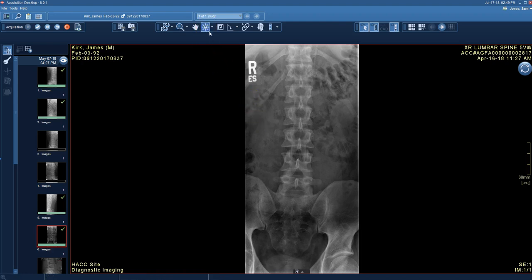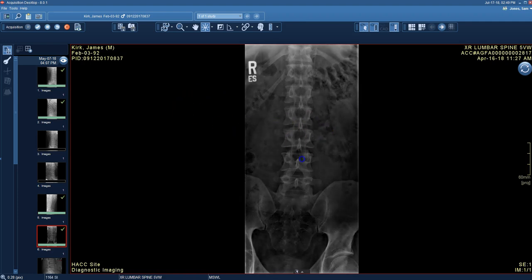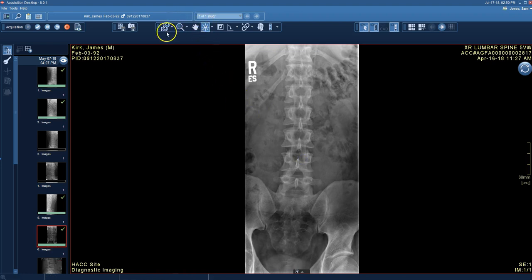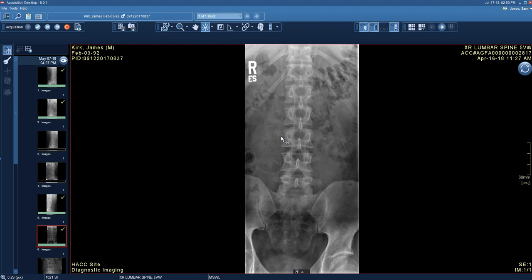Another way to do window level is to click the starburst icon on the toolbar, which attaches the starburst tool to the pointer. Left-click and hold, and you can adjust window level that way as well. So you have two options: right-click and hold, or use the starburst tool from the toolbar. Those are your zoom, pan, and window level tools — that's how you get into PACS, search for studies, and view patient images.